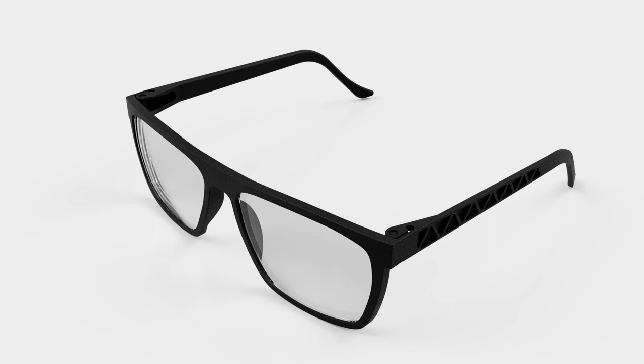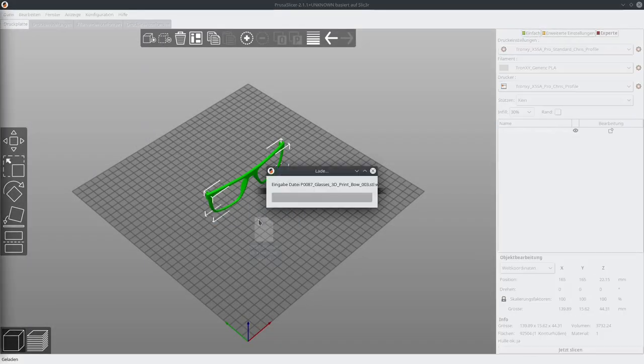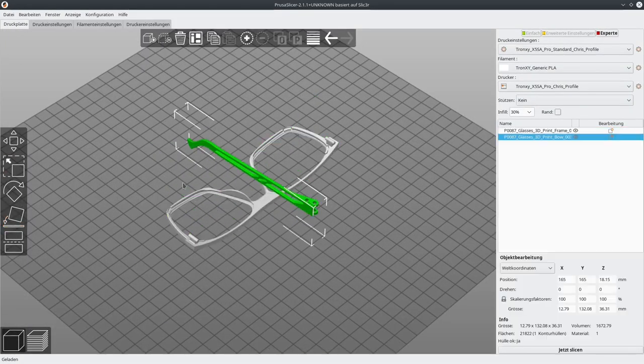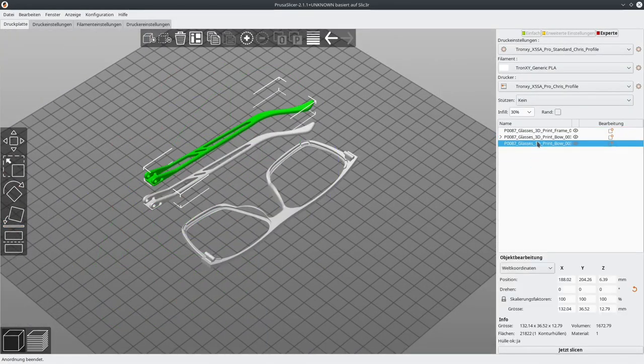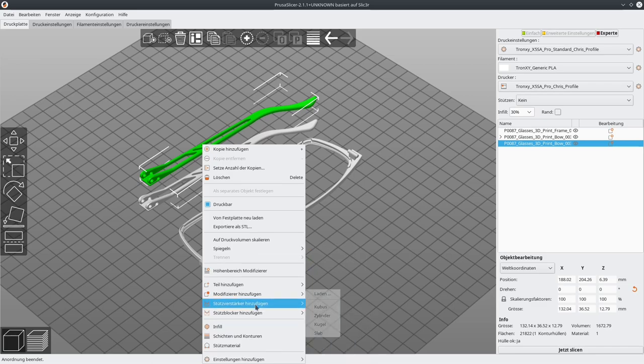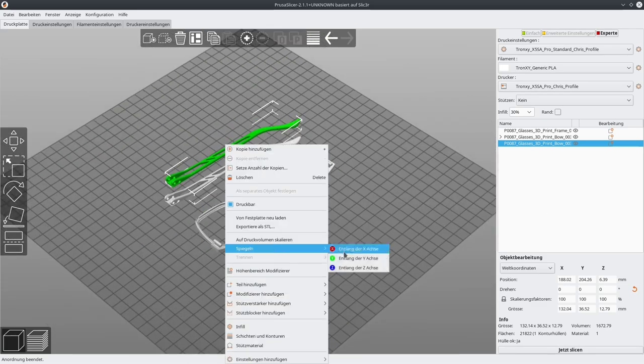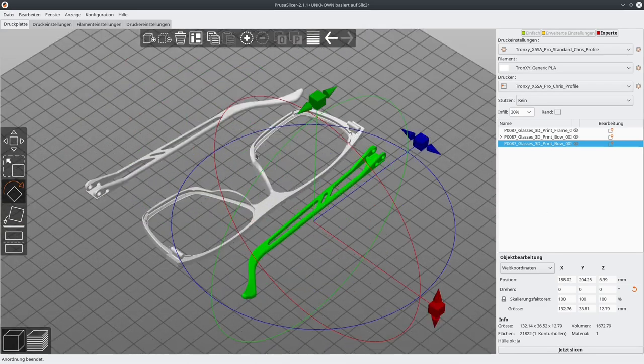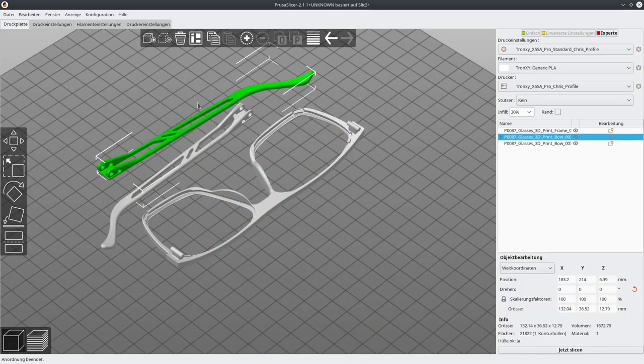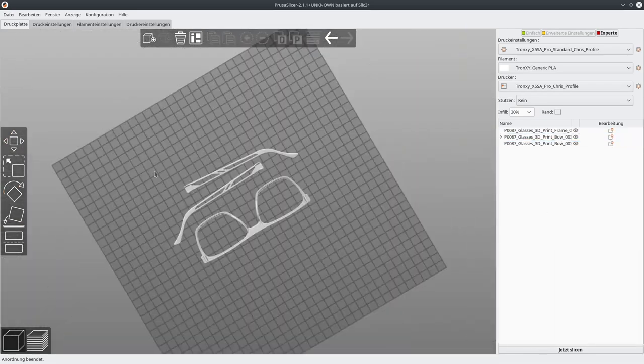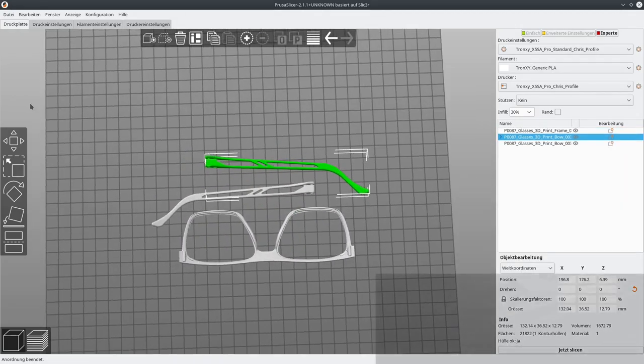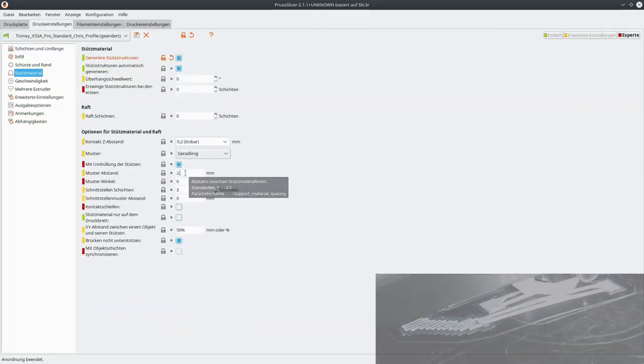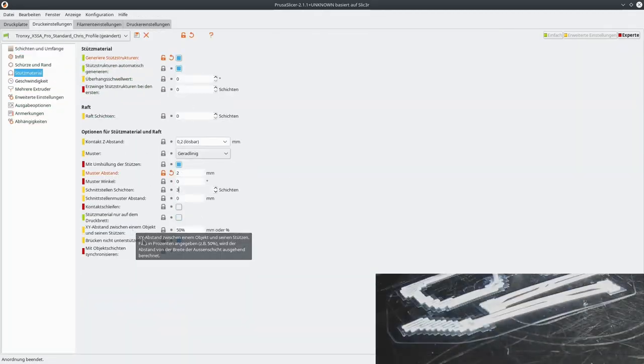With the first design done, we can now start producing hardware prototypes. In order to make sure the basic design works and fits my oblong head, I printed the first prototype using my desktop 3D printer. For designs like this, you will need tons of supports.